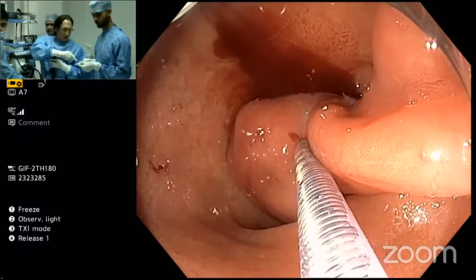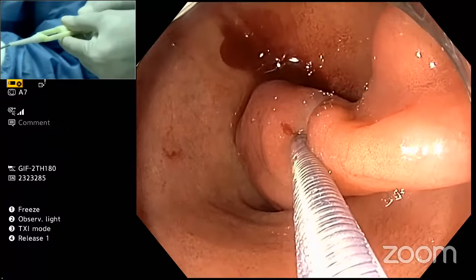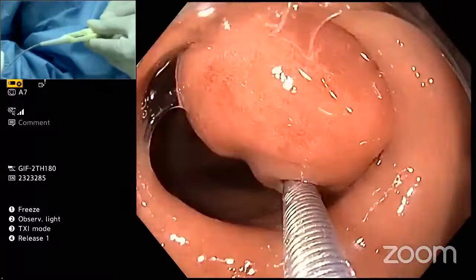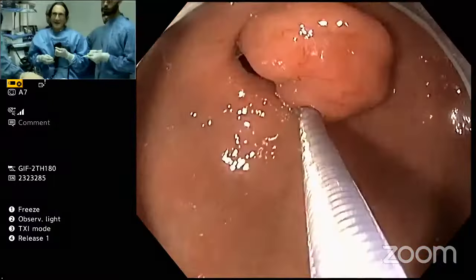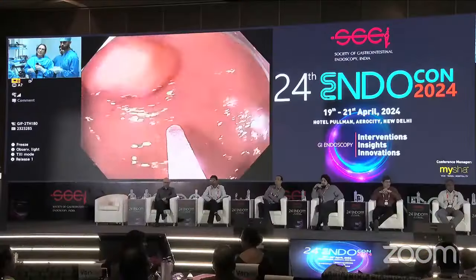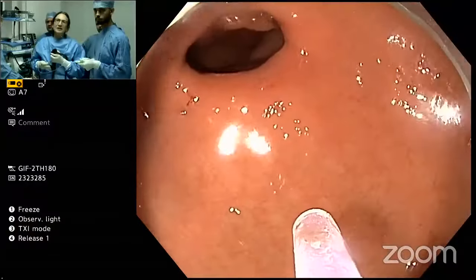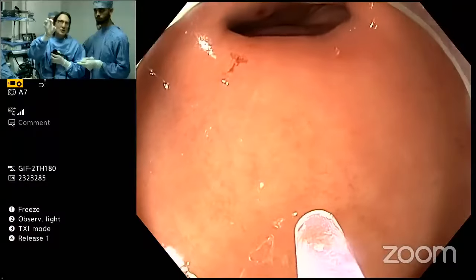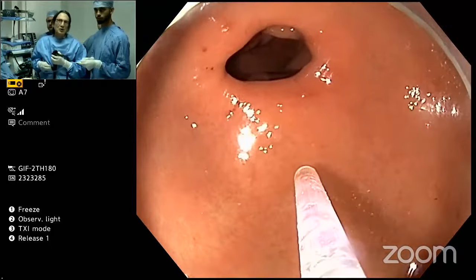So let's try. What you're doing now is you're pulling everything back. Pull this all the way back. And when it's fully back, it's supposed to go click or something. And it's supposed to disengage. You can see how I'm able to retract like this. So the problem is, you can see, push it out, please. I'm sorry. The problem is that I don't have a structure that's holding the loop firm enough for me to pull out to release the suture.